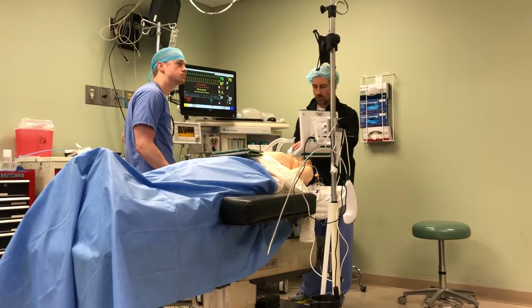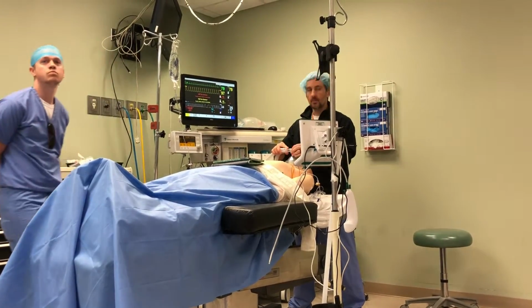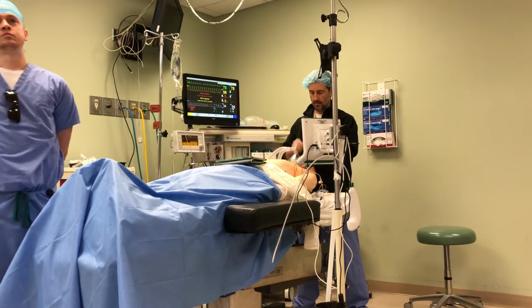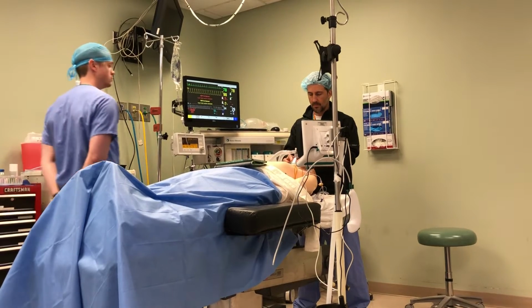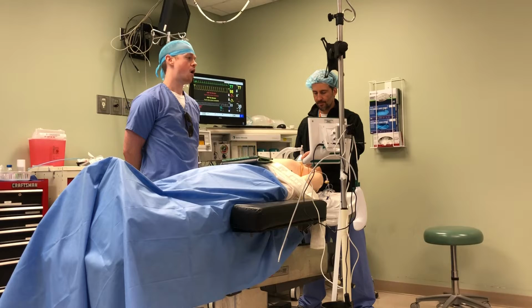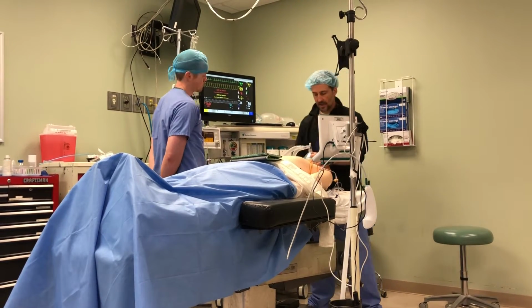Make sense? Good question. Now, obviously different with the nasal cannula, right? Yes. Because now what you're doing is delivering that with a mask coming from the machine is 100%. So it doesn't matter about the liters. So he's got that end tidal O2 is above 85.